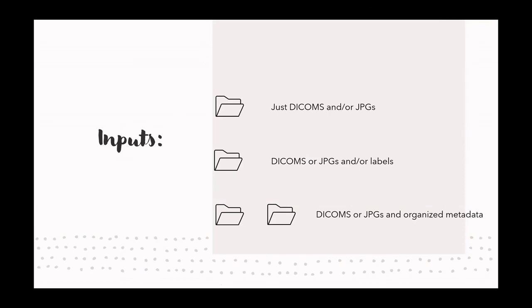It automates the data cleaning, exploration, and augmentation processes to some extent that you need to build a machine learning product about chest x-rays.